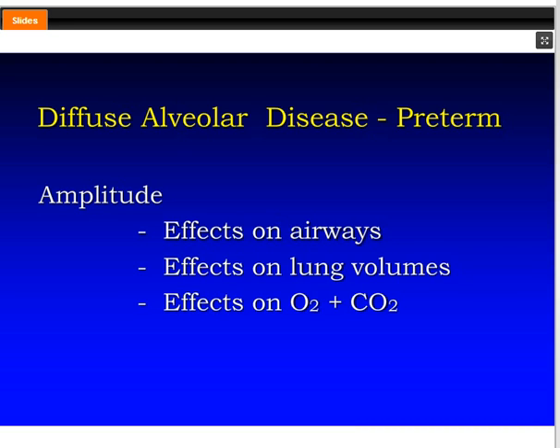And if you develop atelectasis, then amplitude becomes a very important part in opening up that area of atelectasis. As we all also know, repositioning the baby with the good side down may also help you improve that from that standpoint.